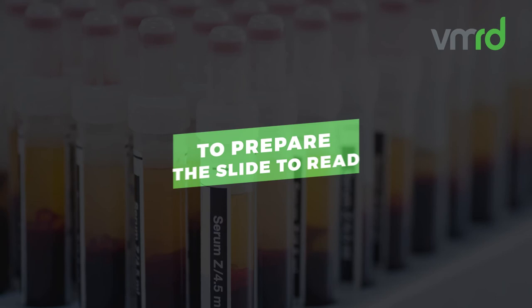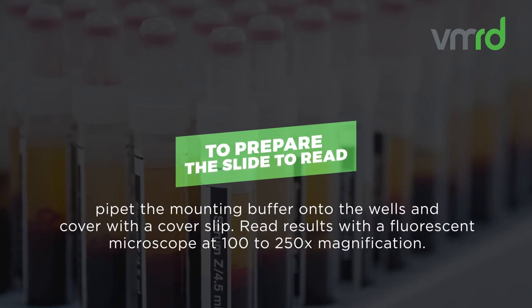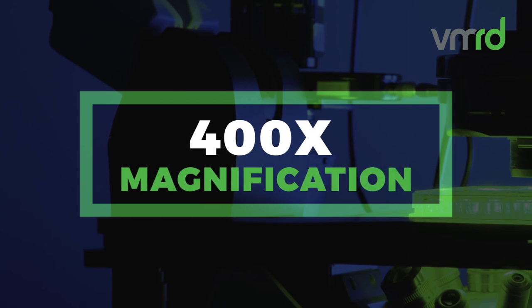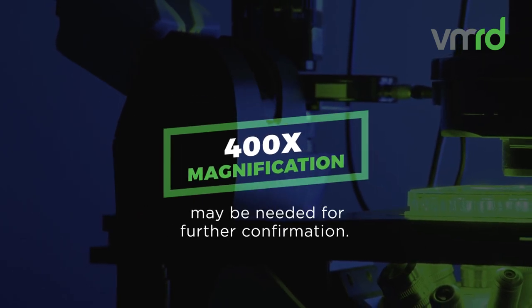To prepare the slide to read, pipette the mounting buffer onto the wells and cover with the coverslip. Read results with a fluorescent microscope at 100 to 250 times magnification. 400 times magnification may be needed for further confirmation.